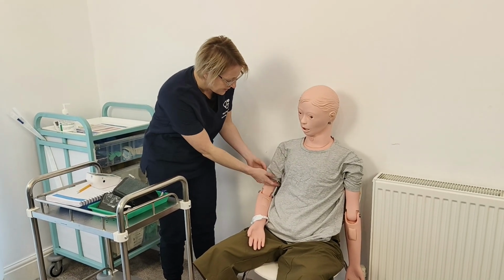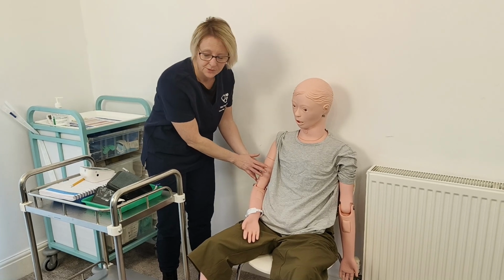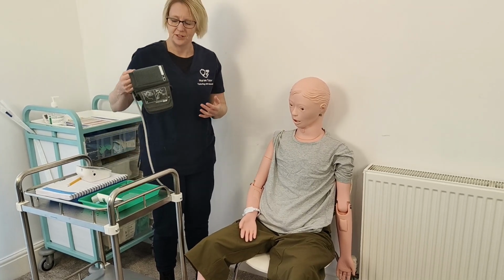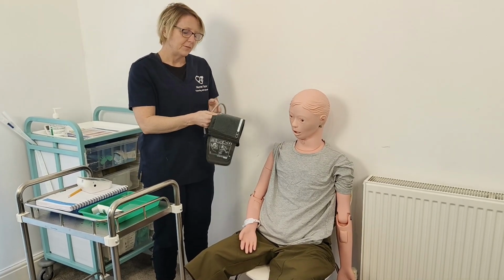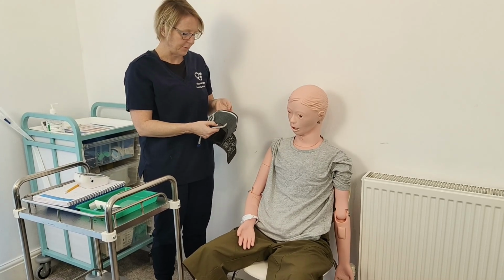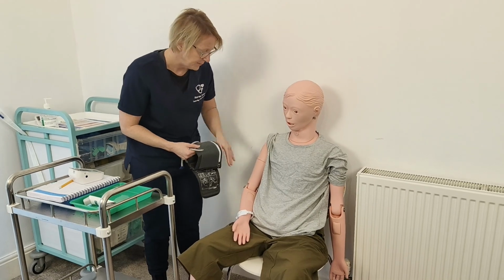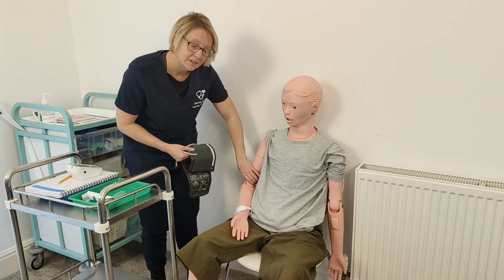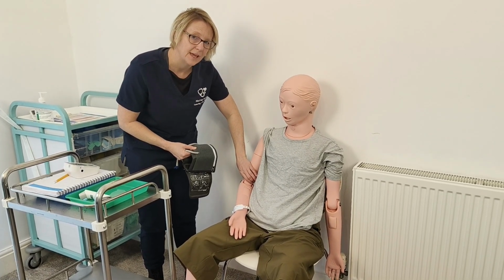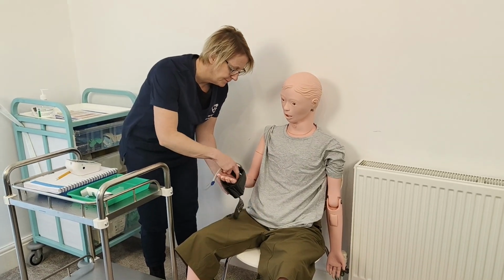No, okay, so I'm just going to check, and there's no cannula, and I'm happy that there's no soreness or wounds here, so I'm going to place the blood pressure cuff on. When we record an electronic blood pressure, we should make sure the arrow or the A on the blood pressure cuff aligns with the brachial artery. So we want to palpate the brachial artery on the inner aspect of the elbow. And we're going to place the cuff 2 to 3 centimetres above that.